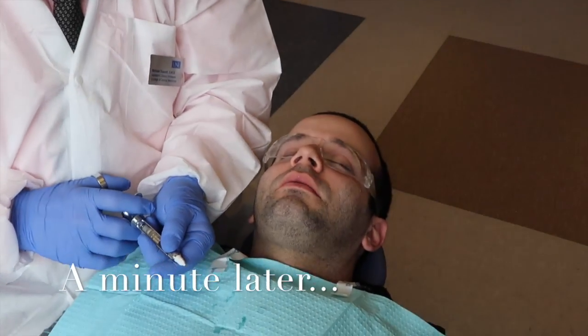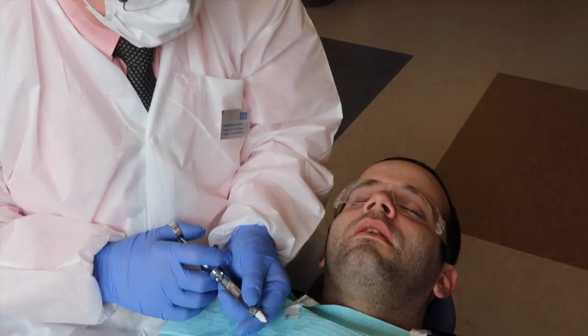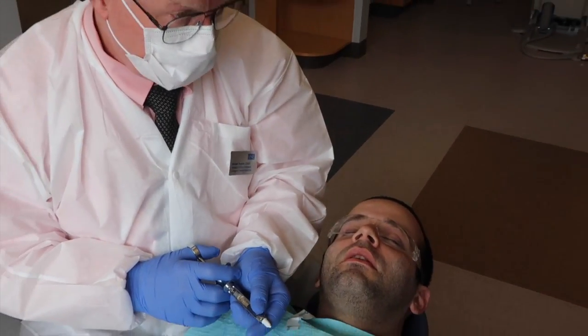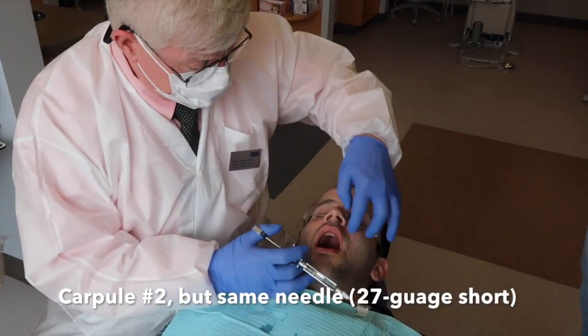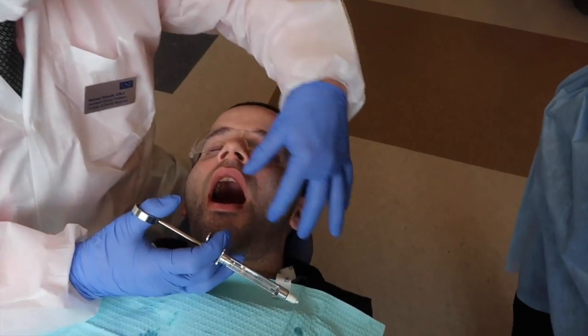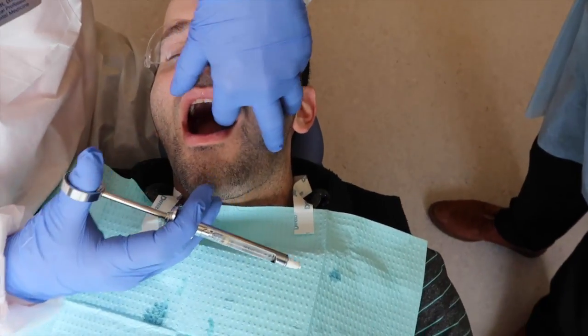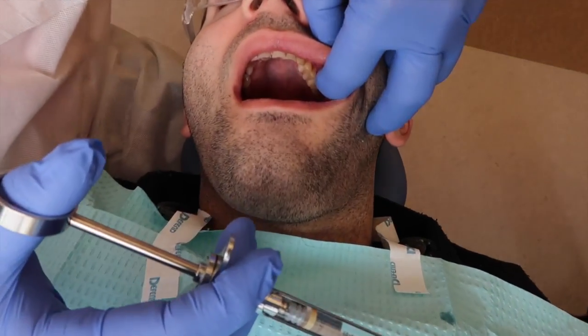I typically give two carpules for every procedure — not necessarily all the time, but the second one I believe is because of the lingual root. At this point we have good anesthesia all through the area.